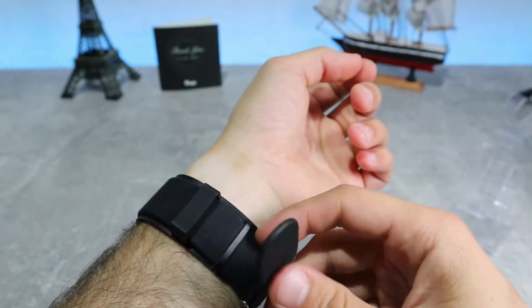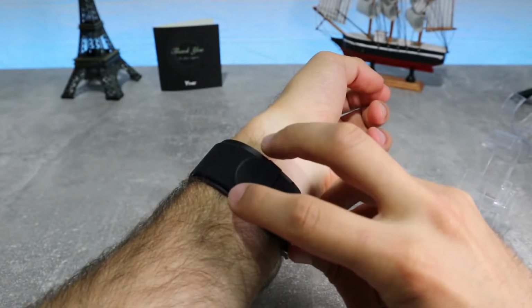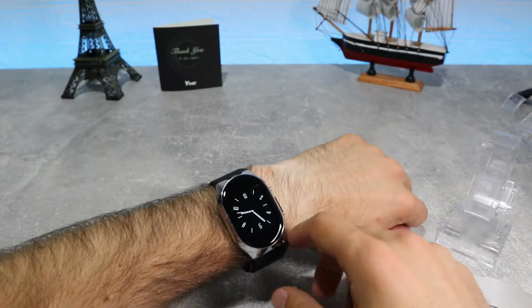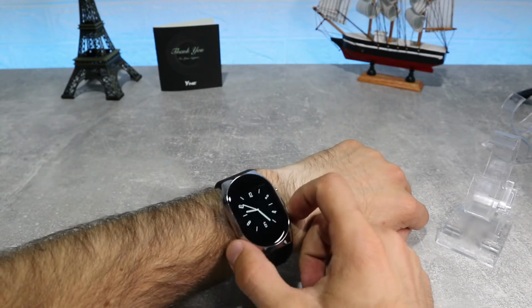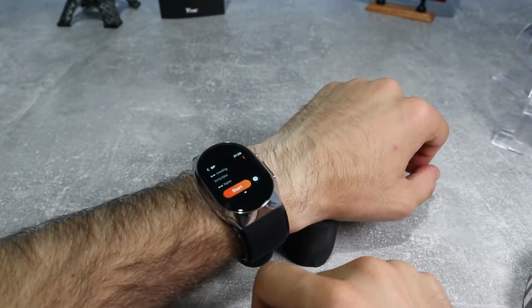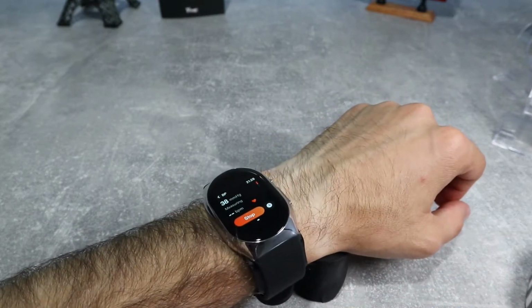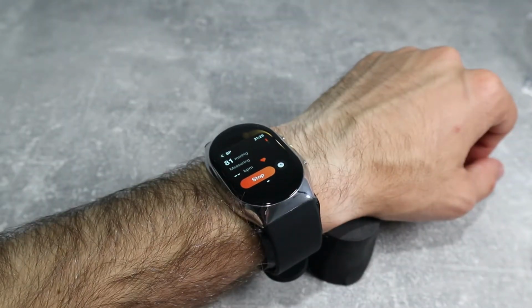It's equally important to be relaxed during measurement, and make sure you haven't exercised or drunk coffee/energy drinks at least 30 minutes before. Do not talk or move during the measurement either. There are 2 ways to start the measurement, either through the menu as seen before or by pressing the home button for 2 seconds, in which case the measurement will start automatically.